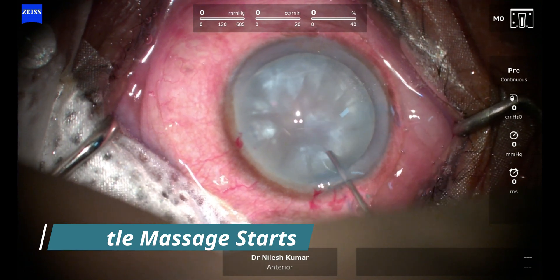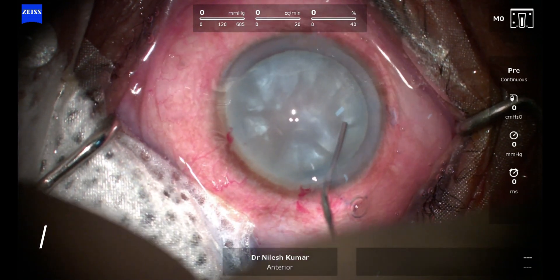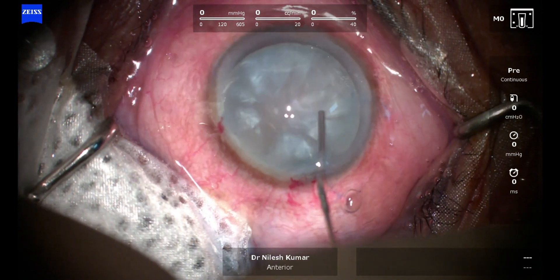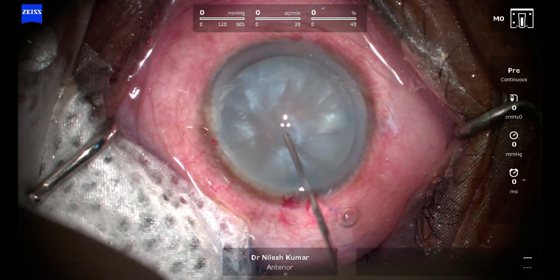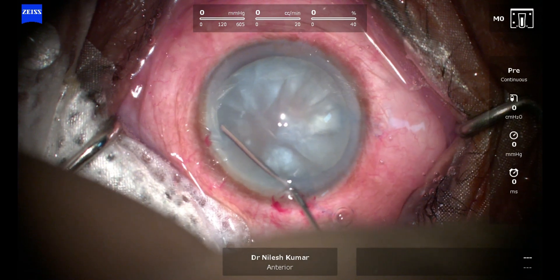I have not seen any zonular laxity or zonular compromise following this technique. It should not be very vigorous — the aim as always should be to break all the pockets of fluid. You can actually see how the pockets are being broken and have started communicating with each other.